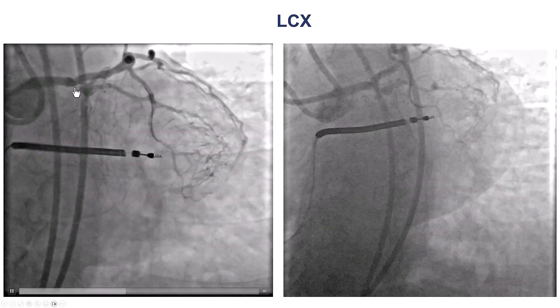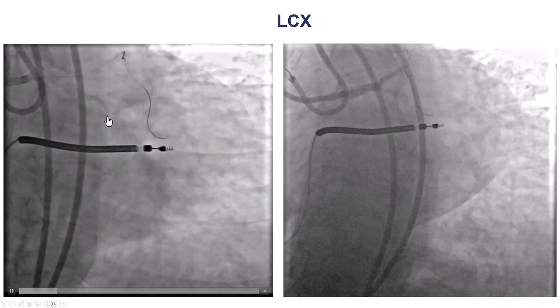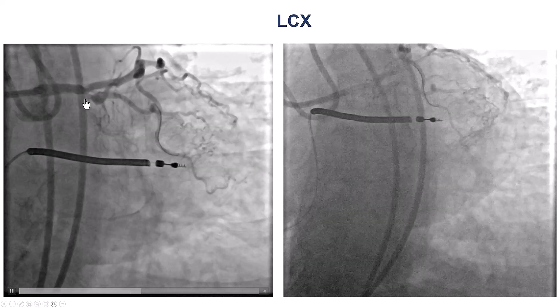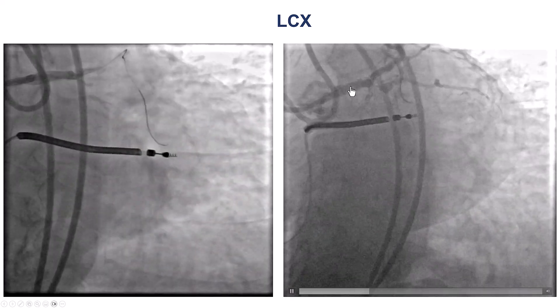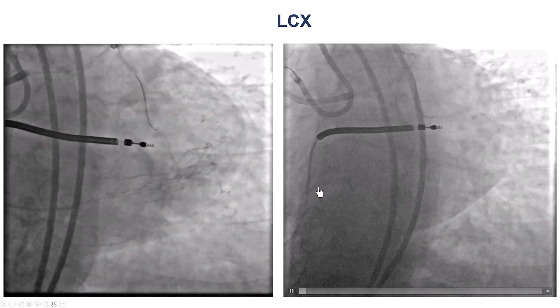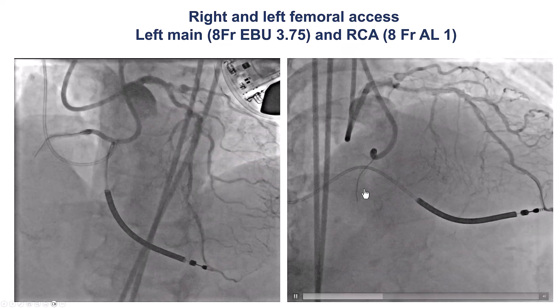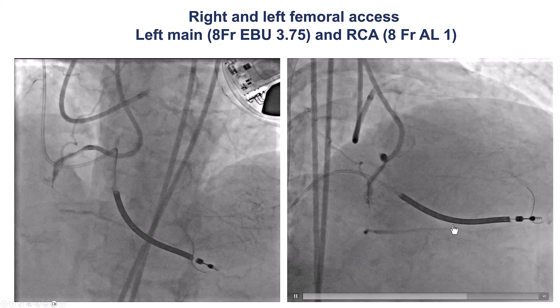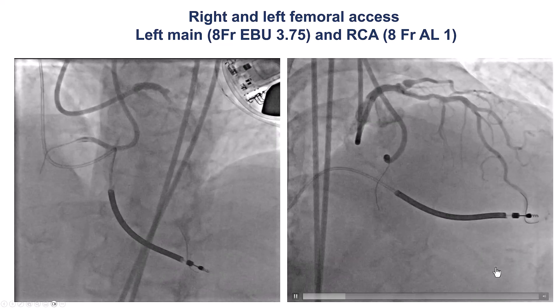The coronary angiogram shows a tight proximal circumflex lesion and a chronic occlusion in the mid-circumflex after the takeoff of this large marginal branch. The LAD doesn't have any severe lesions. There are collaterals filling the distal RCA and the right posterolateral. The right coronary artery is occluded in the mid-segment, with the distal vessel filling through both septal as well as epicardial collaterals.